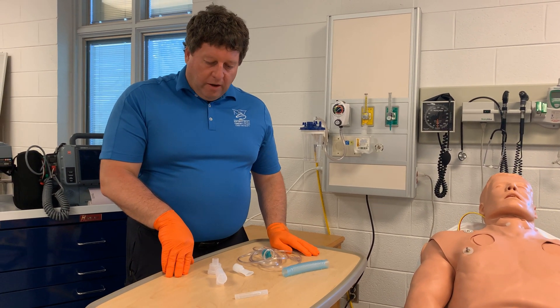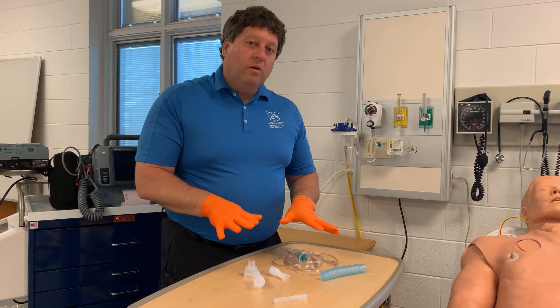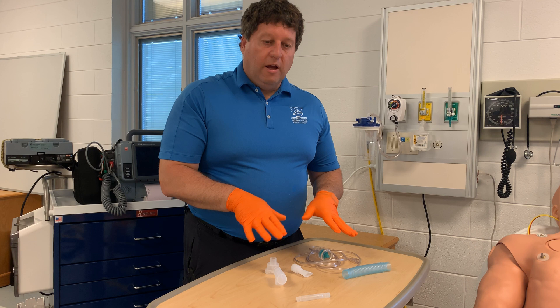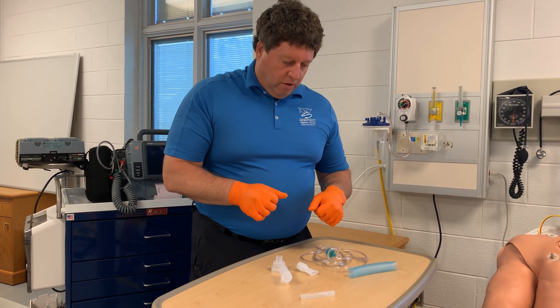When you open up the small volume nebulizer, all these parts are in there. This is something that we typically don't do as EMTs, but advanced EMTs and paramedics can administer albuterol. As an EMT you may be assisting your partner with it, or you may assist the patient with it.